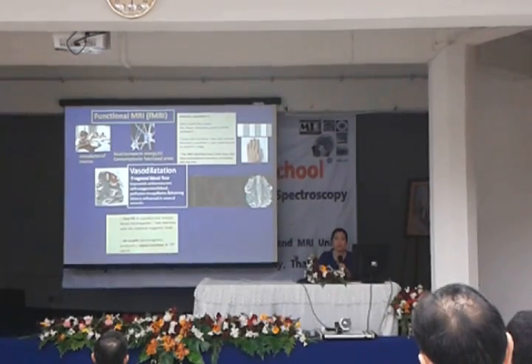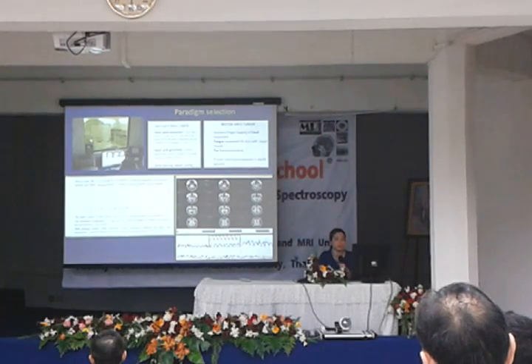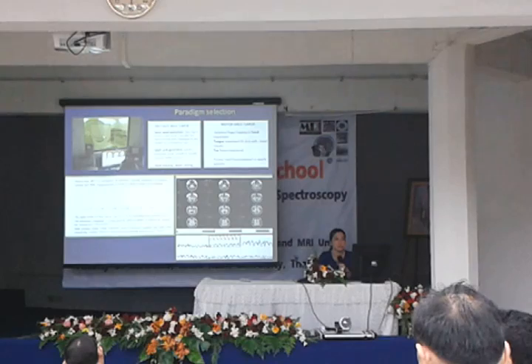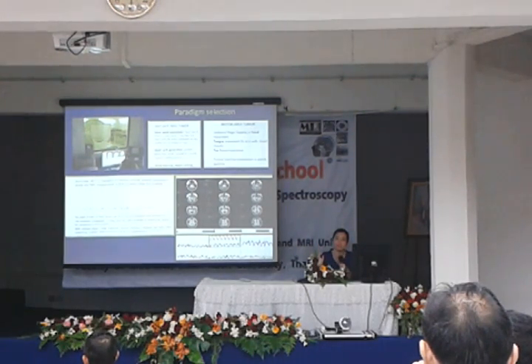And when the area of the brain is working, it brightens up with color. But the signal time course and the task that the patient is doing have to be synchronized. That's very important. How does it work? The patient lies down on the bed and can see the big screen, and we put up a symbol so they know when they have to work or stop, work and stop, repeated over and over.